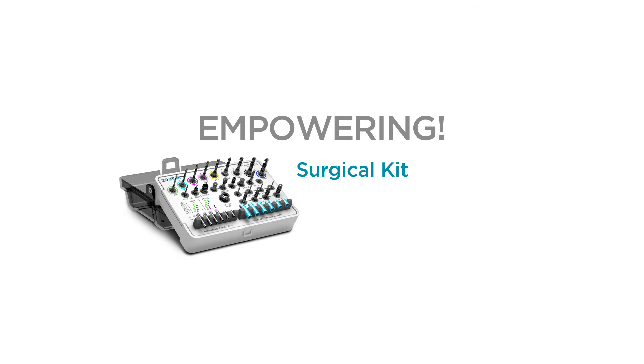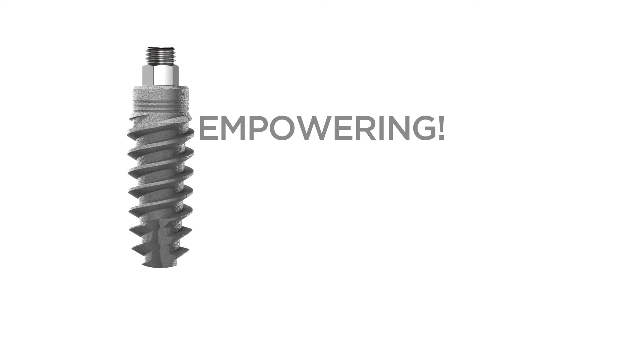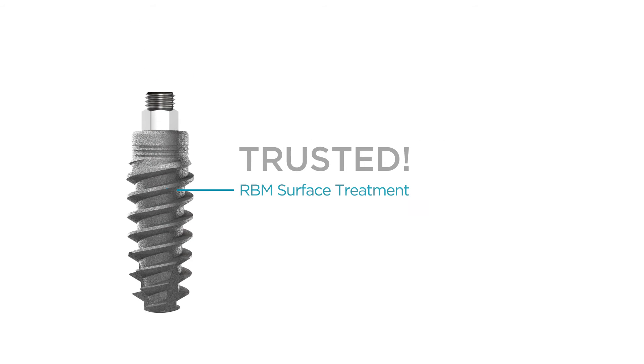The newly designed Zest Locator Surgical Kit makes it easy for doctors of all training levels to achieve outstanding results. It empowers you to do outstanding work for every patient, not just those with accommodating anatomy. The implant's progressive diameter design, self-tapping tip, and RBM-treated surface streamlines the workflow for all bone types.